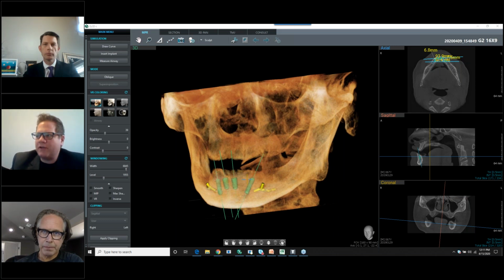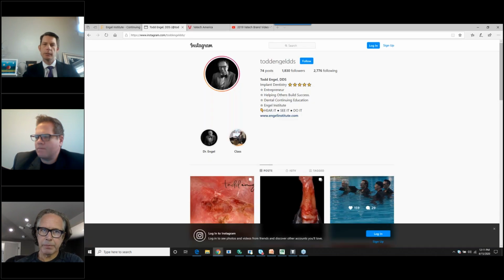Why did you use 30 degrees for those multiple implants? The all-in-4 there. Is this all me?